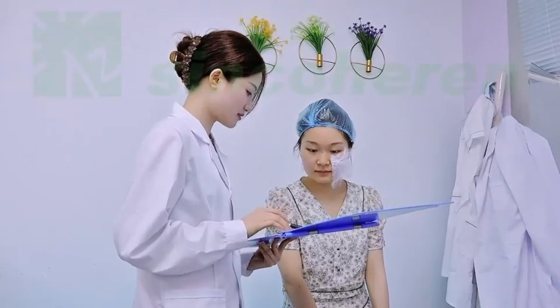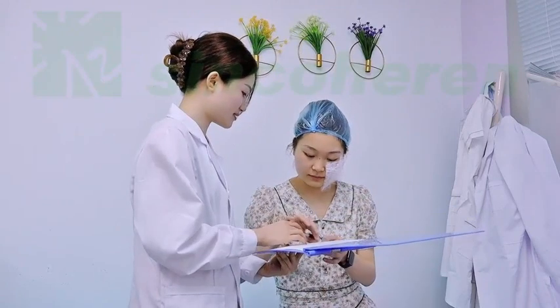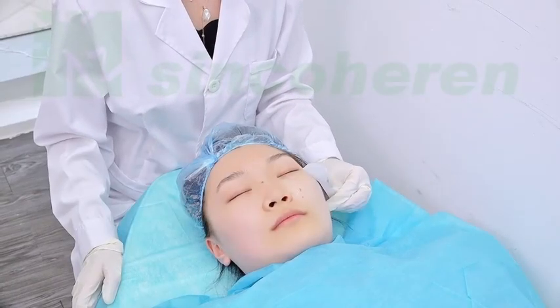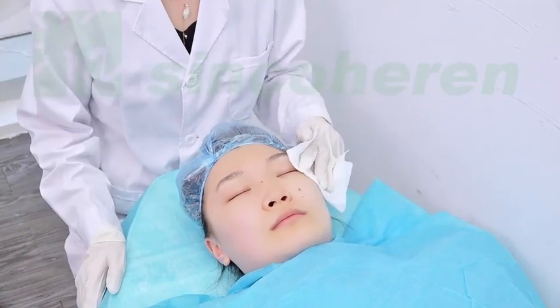Patient preparation: be informed of the contraindications. Sign the consent form. Be informed of the post-operative precautions and possible conditions. In 30 minutes, the doctor is removing the anesthetics and cleaning the face again.